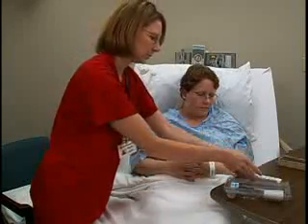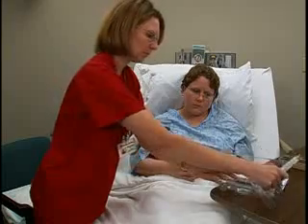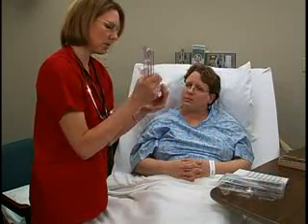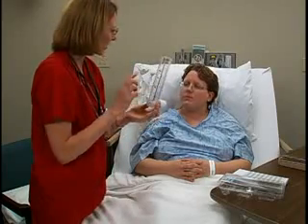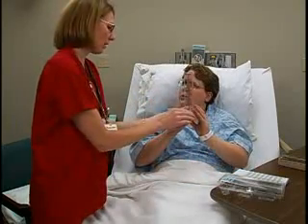Okay. Then slide the mouthpiece into the base of the numbered scale. I'm going to stick it on here for you. What we're going to do is try to shoot for the top. Instruct the patient to take a deep breath. Okay? One time. Put the mouthpiece in her mouth and close her lips, making a firm seal. Put your hands on the back of it. Just hold it here.